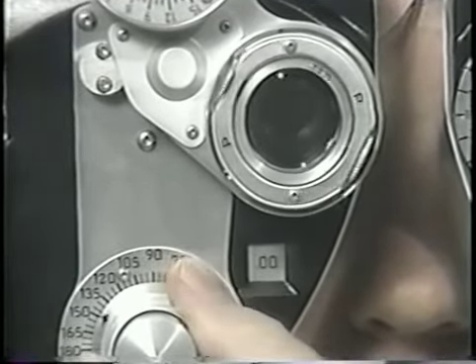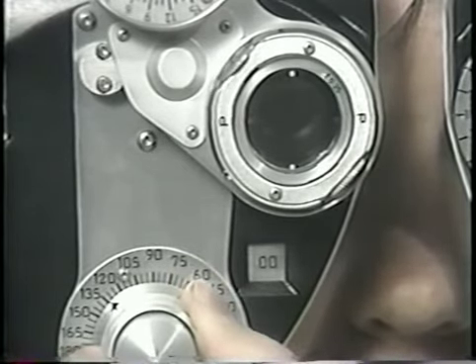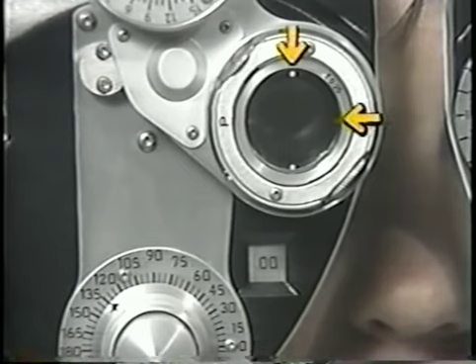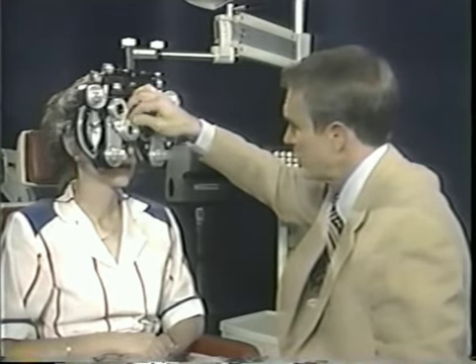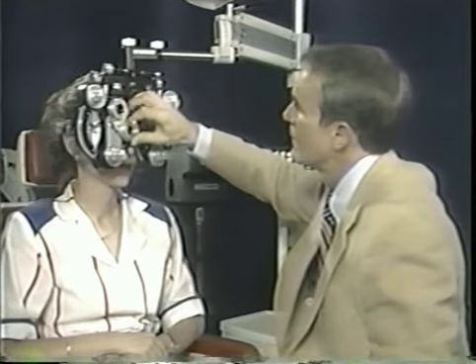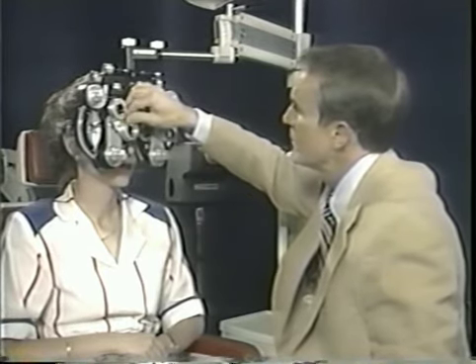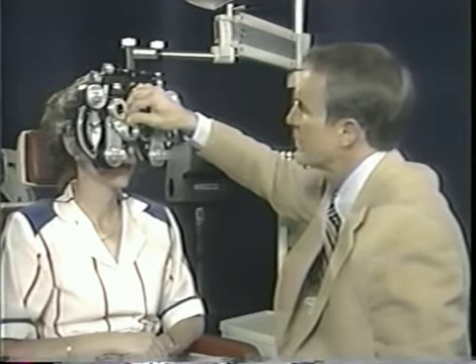If no cylinder is present, however, it is most efficient to look for cylinder first with the cross-cylinder axes oriented in the 90 and 180 degree meridians. More patients have astigmatism with a vertical or horizontal axis than an oblique axis. The patient is asked to choose between the 2 flip choices. Again, it is important to get the patient's attention, say what you're going to do, ask a question with limited answers, and call attention to the change. Let's listen from the start.